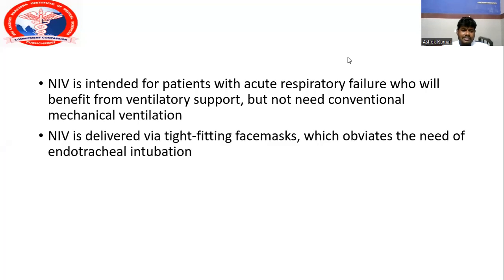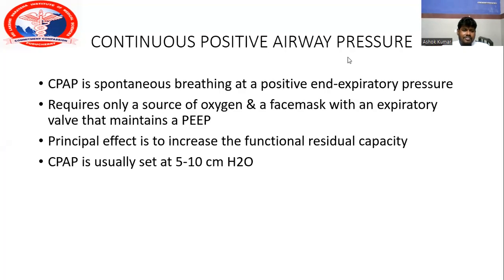Non-invasive ventilation is intended for patients with acute respiratory failure who benefit from ventilator support but do not need conventional mechanical ventilation. Non-invasive ventilation is delivered with a tight fitting mask, which obviates the need for endotracheal intubation.